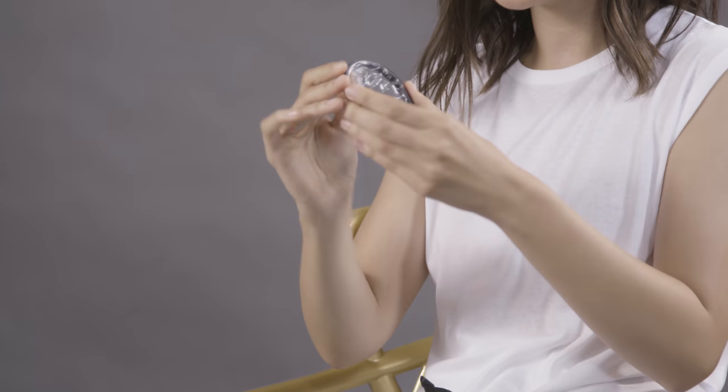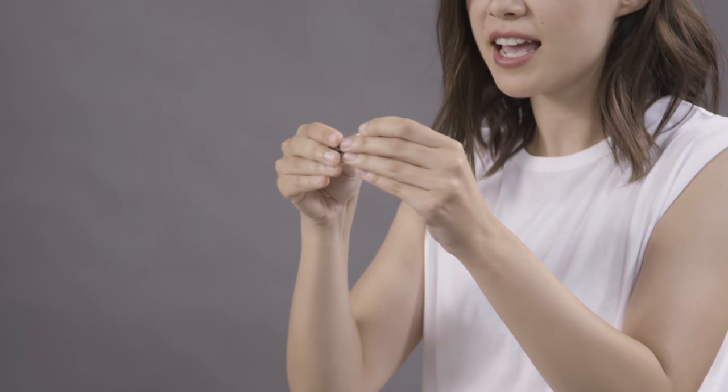The first thing I did when I got Flex was open up the package because I wanted to see what it looked like, and then I just started feeling it and squishing it. I actually still have this first one because I use it as my display to show people — like, look at this cool thing, look how squishy and flexible it is.